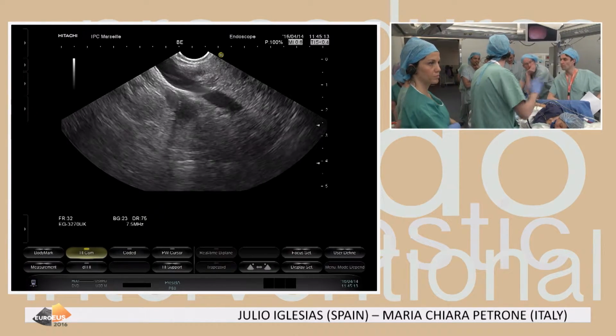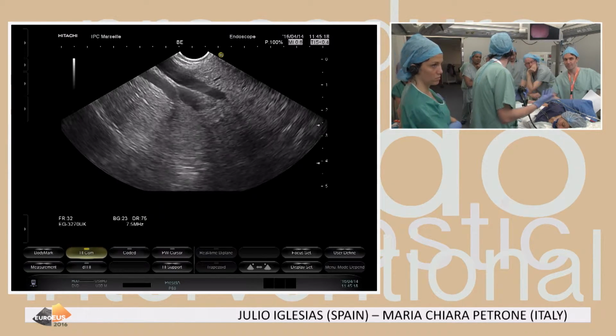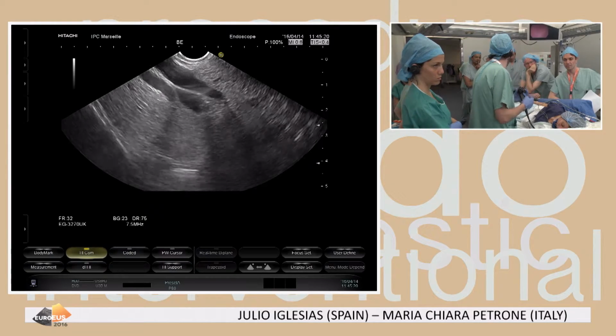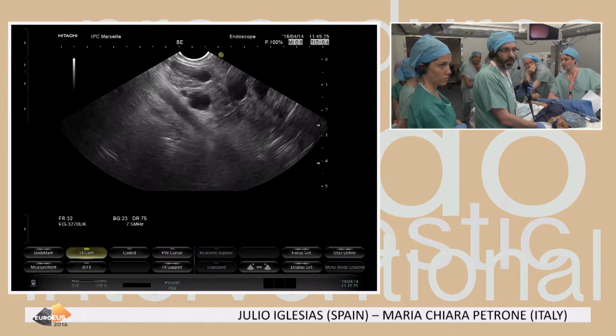even we will just skip, just with the Sonoview, no enhancement, we will skip FNA. But probably in a young patient that we might think on doing a surgery, it might be not a bad option to make an FNA with a 25-gauge needle. And of course, the idea is to try to target the nodule always.